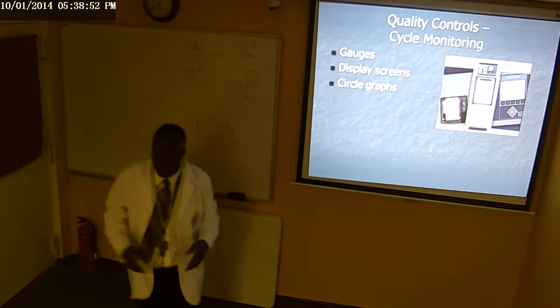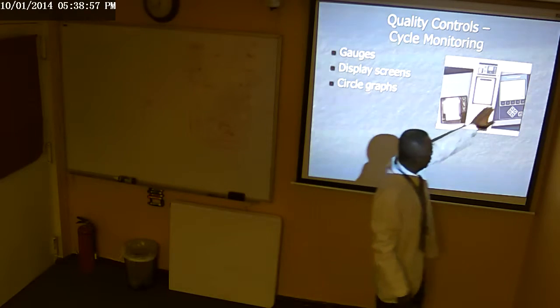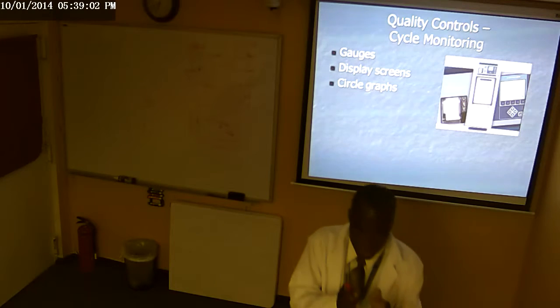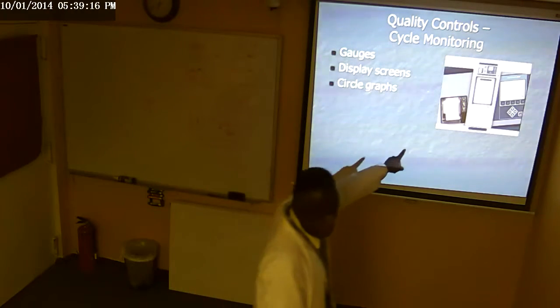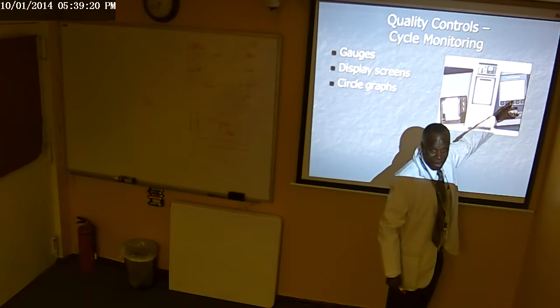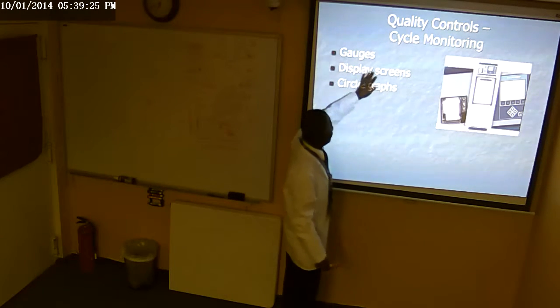And then the display screen, that's this screen here. It should be telling you the conditioning phase, the temperature, the pressure, and all those things. It's like the display screen of your car or of your cell phone, right? Same thing. So this one here gives you a visual impression of the process going on. Once the process stops, it's no longer there.